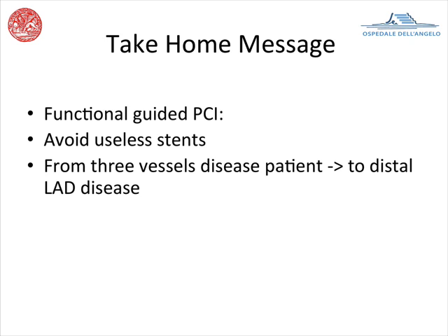In the presence of a very diffuse disease, functional guided PCI is a good tool to avoid useless, unnecessary stents with a significant functional improvement.